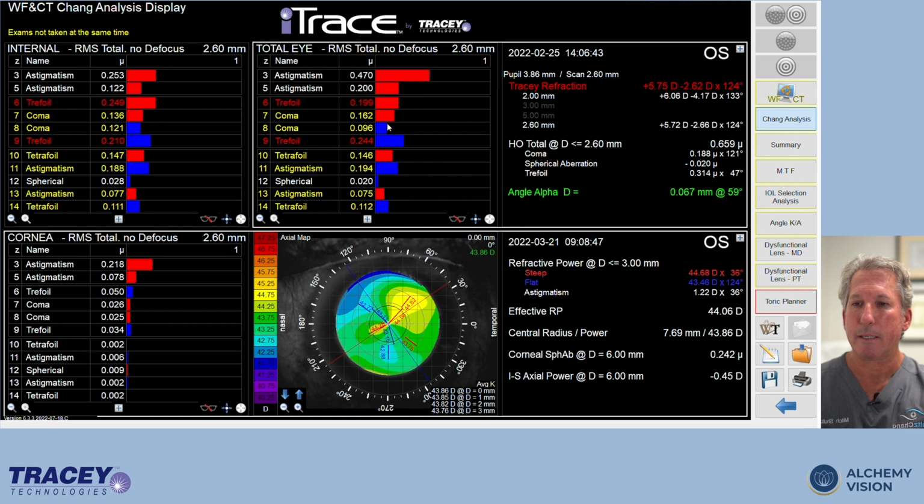As you can see here, the patient has refractive astigmatism of about 2.5 diopters. That's because some of the astigmatism is coming from the lens. But what's most important is to pay attention to the corneal astigmatism. So here you can see that they still have about 1.2 diopters of astigmatism, which is visually significant. Their corneal spherical aberration is in a really normal profile here. And you can see that the cornea is pretty well balanced with a fair inferior to superior power ratio.